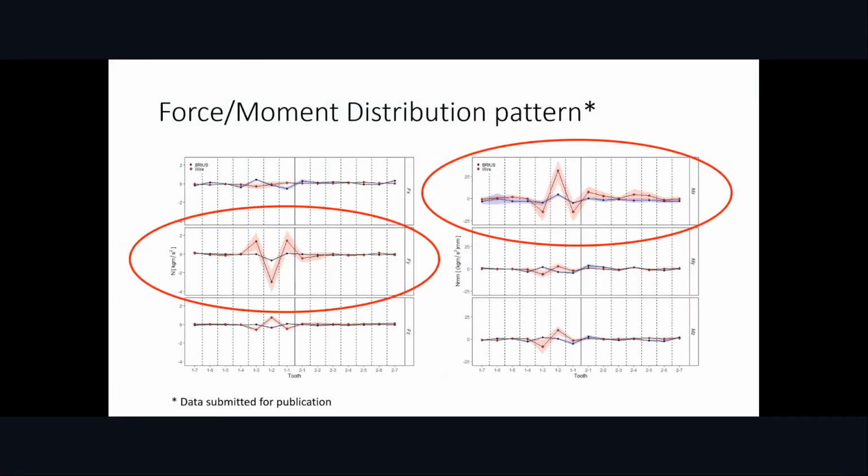So the Brius system, independent tooth movement, is essentially a replication of this scenario. What we're doing with it is we're extending that interbracket distance significantly, and then also we are eliminating the limitations of a straight wire that connects one tooth to the next.